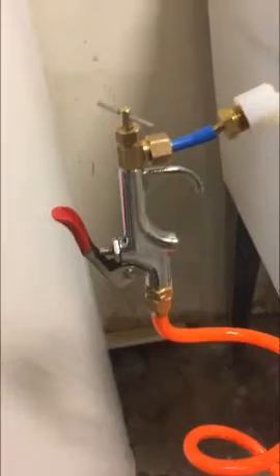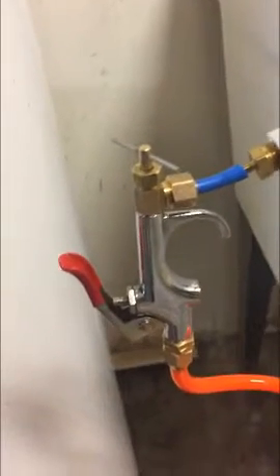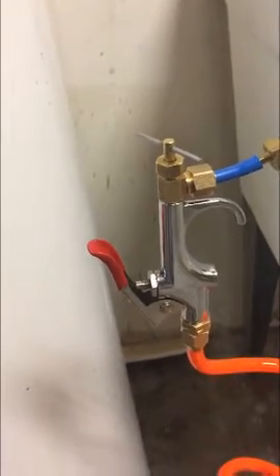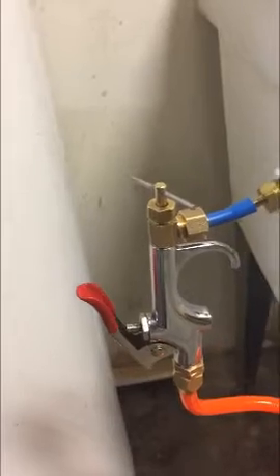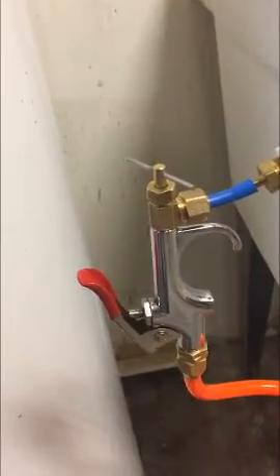Okay, so this is my third iteration and it works quite well. I'm still using an air blower as my on-off valve. That would get replaced by a solenoid valve to work automatically. Above that, I've got a regulator valve from an ice maker, and that has been pre-tuned such that when 1 second of air passes through it at 4 bar, it delivers about 400 cc's of air, which is what the atmospheric volume is that a patient should take in.